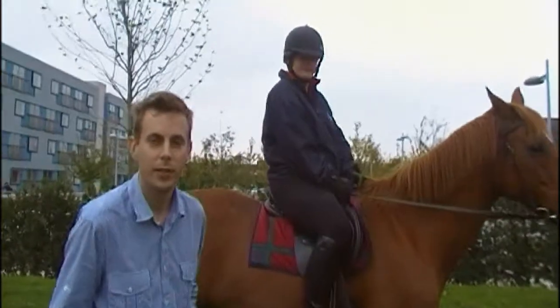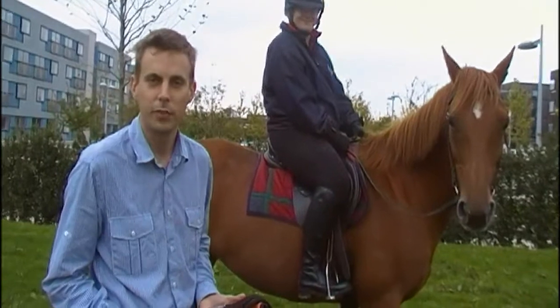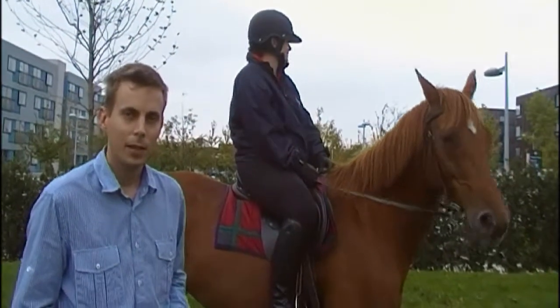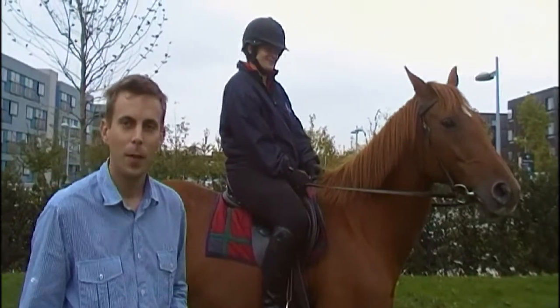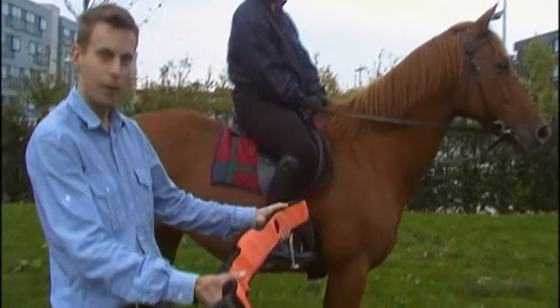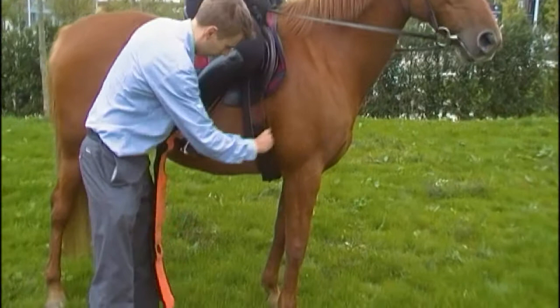My name is Will Bradley, and I'm here presenting the GMAX Equine Performance Monitoring System that we have developed at Cambridge Design Partnership. The system combines a number of biometric sensors into a single easy-to-fit package which fits around the girth of the horse, as you can see fitted to this horse here.